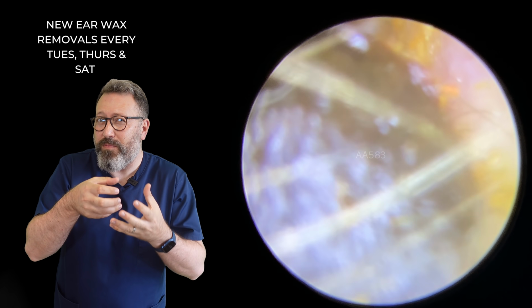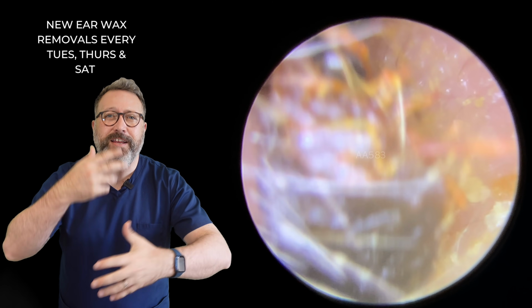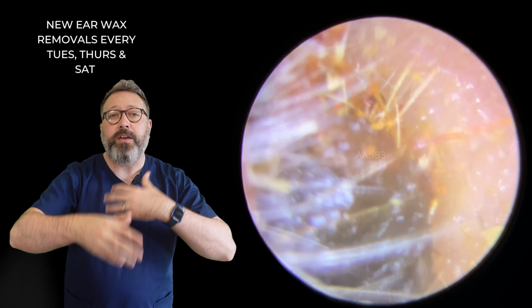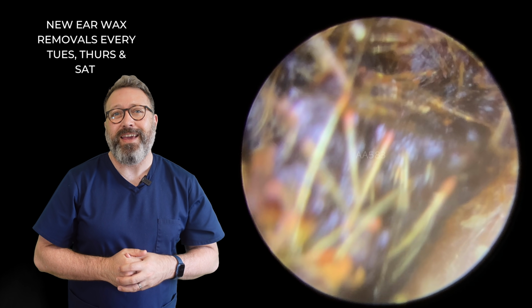We had to put quite a bit of pressure behind it to roll this forwards, and we get that, like I said to you before, that kind of Indiana Jones, that kind of ball rolling down the ear canal. This is what's happening here, this kind of rolling effect of the earwax here. So we're just gonna nip this out. Lots of hairs in there as well.